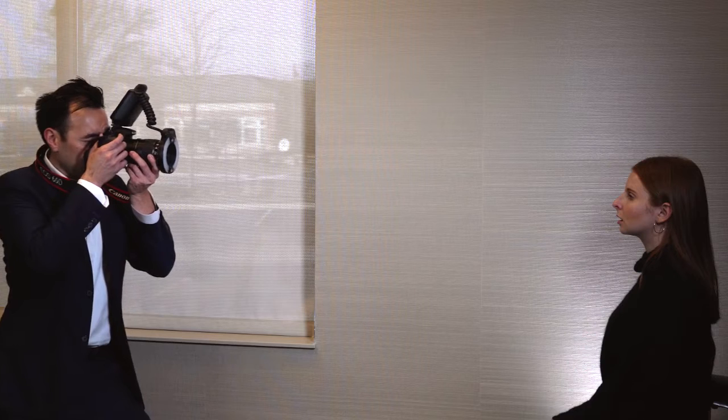Now that I've moved Becca back facing me, I'm going to make sure I can see both sides of her ear evenly. I'm going to tilt her chin down just a little bit and open just a little bit — what we call the Emma or lips-in-repose shot. You want to make sure you see a little bit of space between her lips and her teeth. The lips-in-repose shot helps us when we're treatment planning a smile design. It's really important that we have the correct amount of tooth show that is age appropriate. Some people who are very young have worn their teeth and they no longer show, which can age them quite a bit. We take this photo to decide how much tooth length we need to add, or if there's too much that we need to talk about intrusion or other things of that nature.